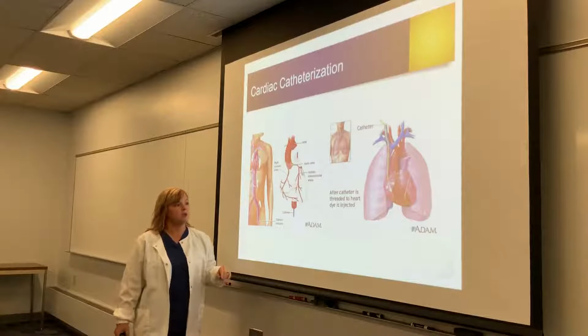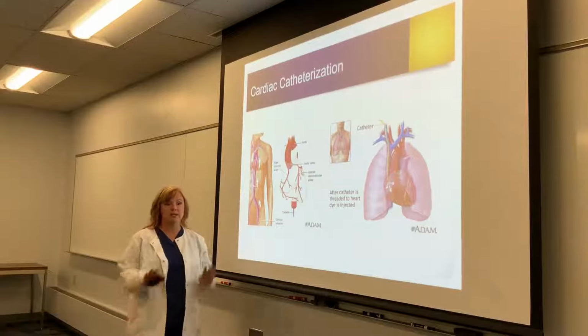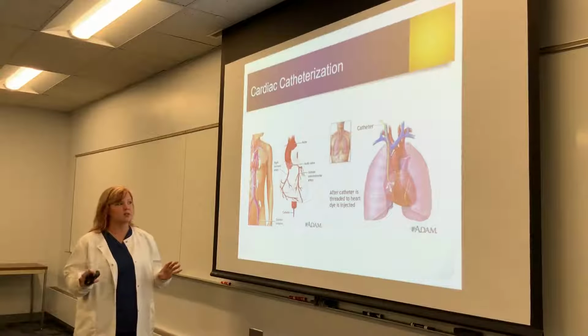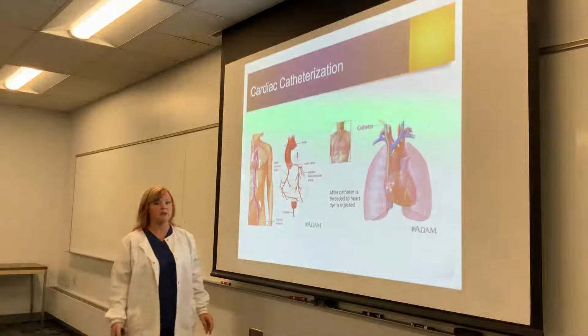So you can get a lot of information through this. You do have to remember that there is dye that is injected during this procedure, and that's so they can see what's going on the screen. So they're looking at everything under fluoroscopy. So the patient will get dye during this procedure.